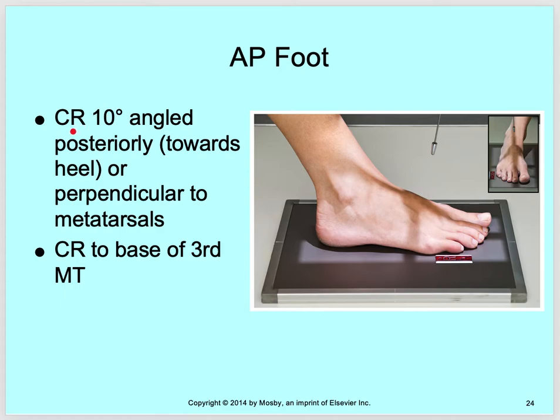So your AP foot, your central ray is angled 10 degrees posteriorly. So once again, we're talking posterior and anterior, not caudad or cephalad. So perpendicular to the metatarsals. So 10 degrees to the metatarsals, and then you're centering at the third metatarsal. So the third metatarsal right there is your central ray.